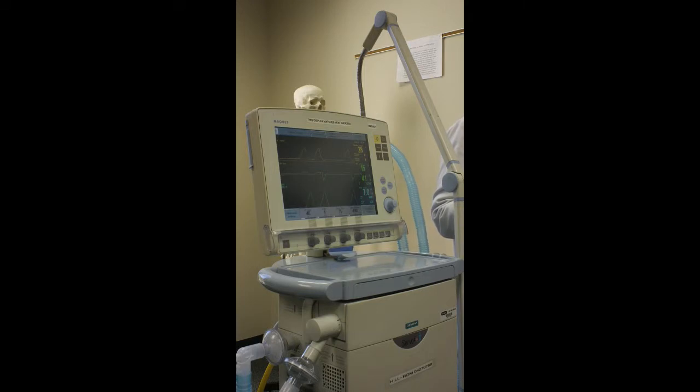Some RTs will put 10, some will put 22. Some will put the total, 22. Some will put just what the patient is doing, and the two of them would equal 22. So just be wary of that, and you'll learn wherever you're at how they do it. If it was me with this vent sheet right here, I would do 12 and 10. I got a set rate of 12, and my patient's doing 10, because my total rate is 22.